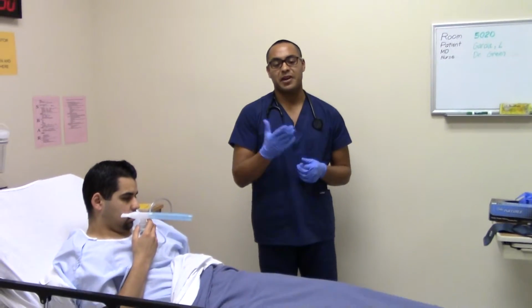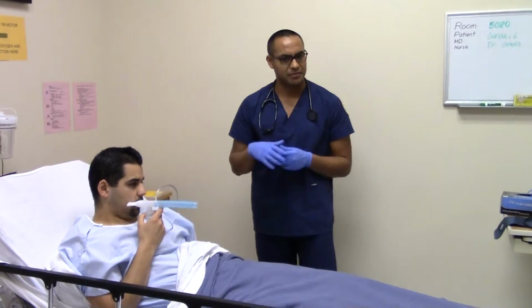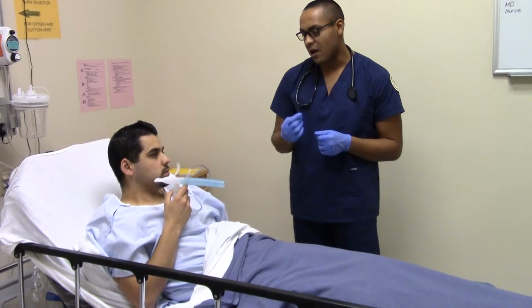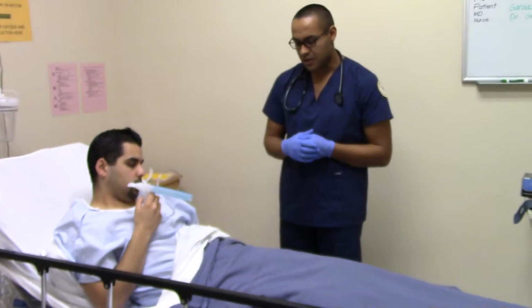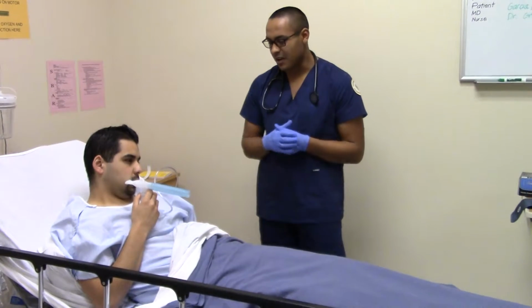Patient mode. Christian, just breathe through your mouth. Don't try to breathe through your nose. Try to breathe through your mouth a lot. And also, you're doing a good job. Thank you.